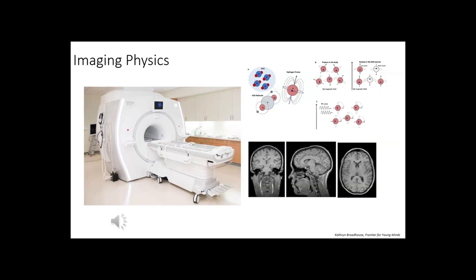So what is this sound? Basically, as I mentioned, if we only have this magnetic field, only half of the protons are going this way and the other half that way. In the brain we see different tissue types, but basically no difference, so how do we get that contrast? We use the electricity in this coil. All the molecules are doing it this way, and we just flip them for a very brief time point when you hear the buzz sound.